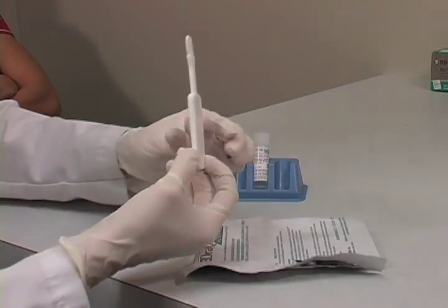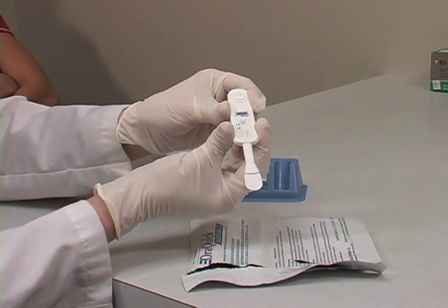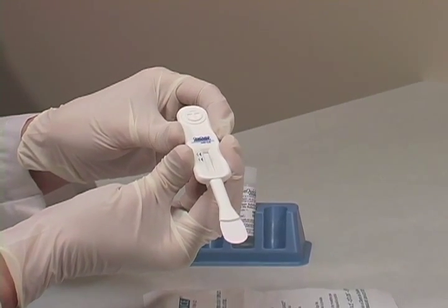Do not touch the flat pad. Check to make sure an absorbent packet is included with the device. If no absorbent packet is present, discard the device and obtain a new pouch for testing.